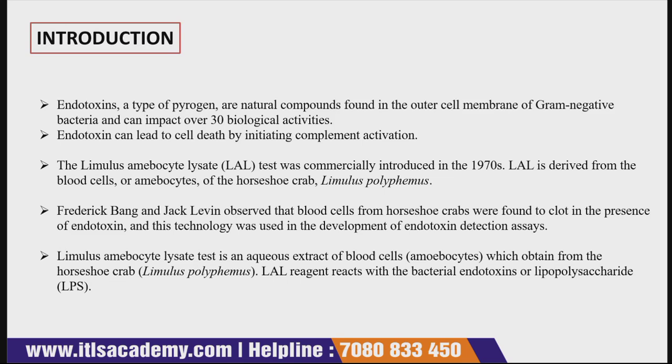The Limulus Amoebocyte Lysate, that is LAL test, was commercially introduced in the 1970s. This LAL is derived from the blood cells or amoebocytes of the horseshoe crab Limulus polyphemus.